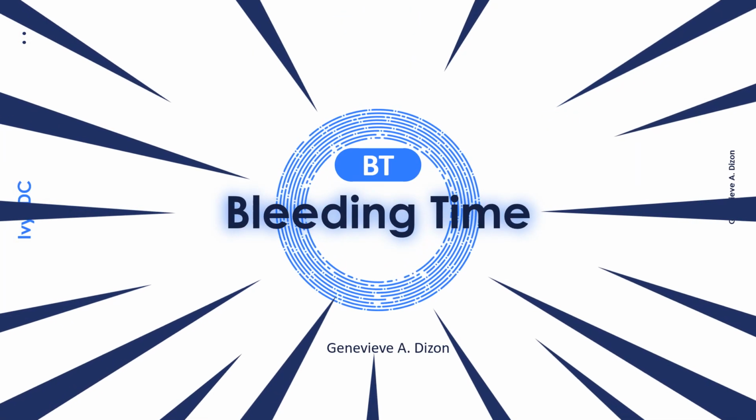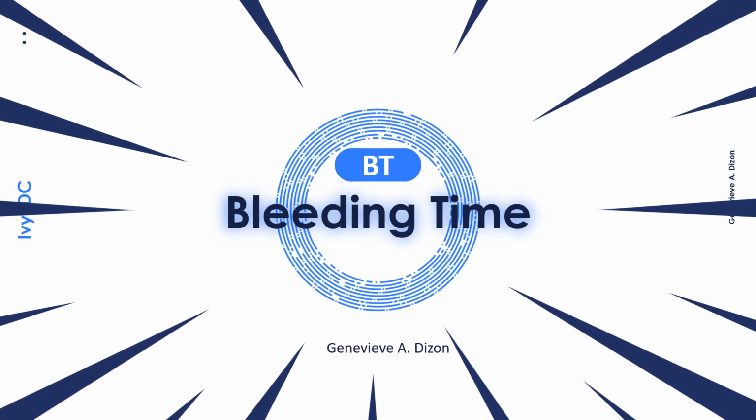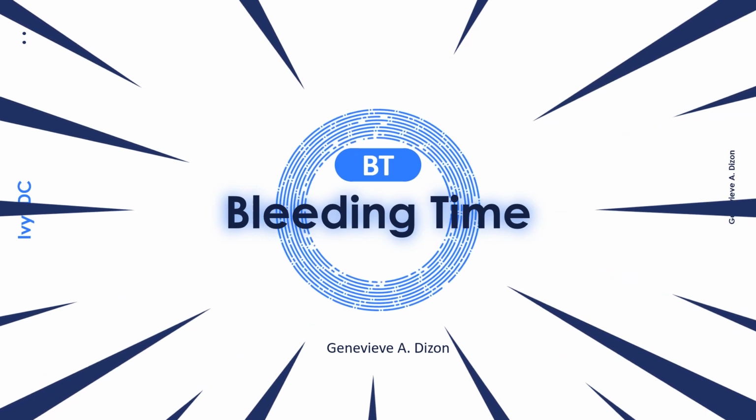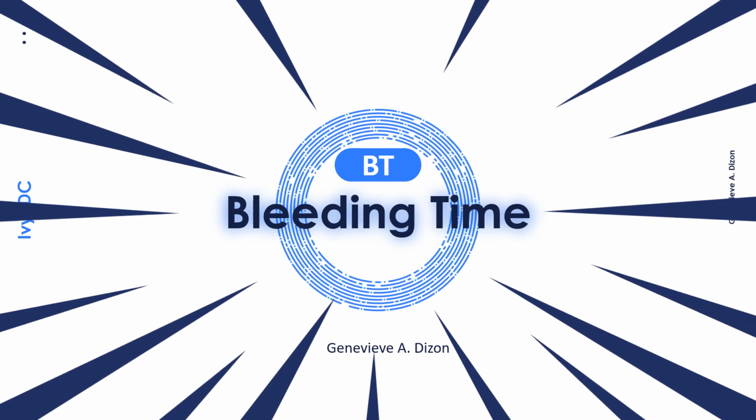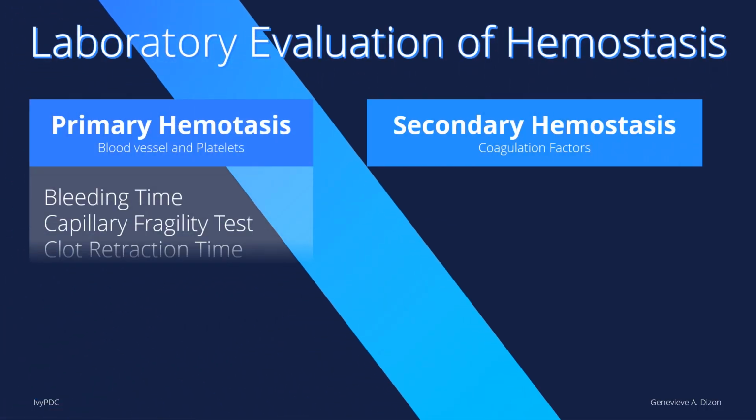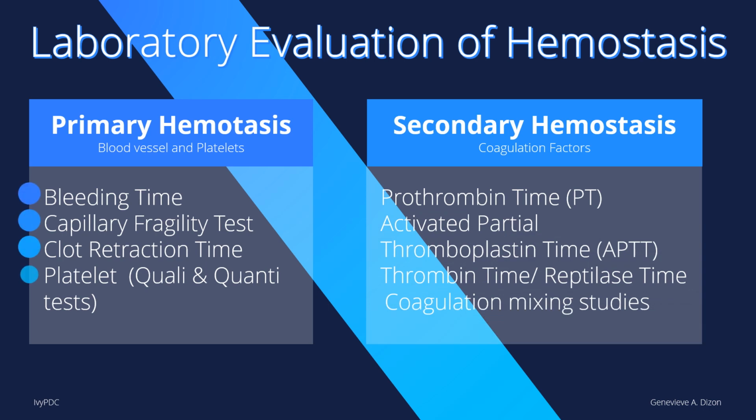Hello everyone, this video will discuss the procedures needed for bleeding time. The laboratory evaluation for hemostasis may either be under the primary or the secondary hemostasis test. Bleeding time is under the primary hemostasis, which tests for any defects in the blood vessels or the platelets.